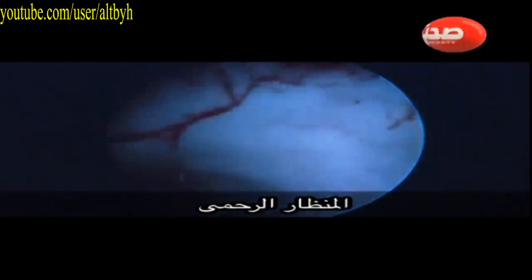This is another subseptate uterus, which was a lady with previous history of recurrent miscarriage, and this was treated successfully.